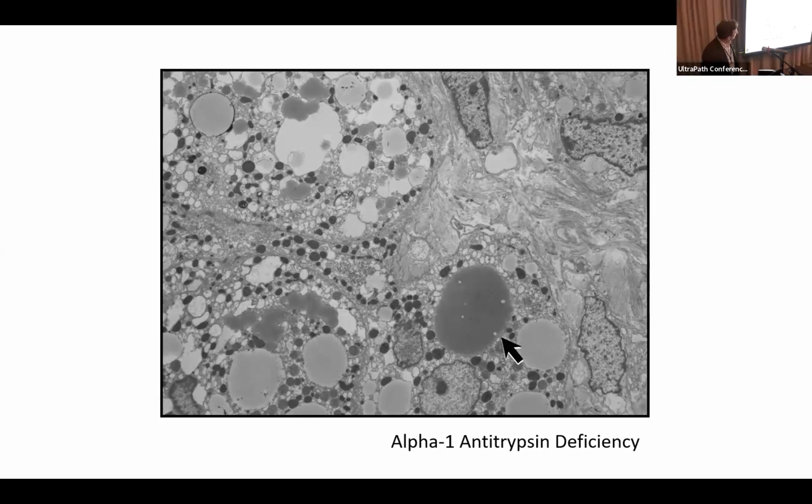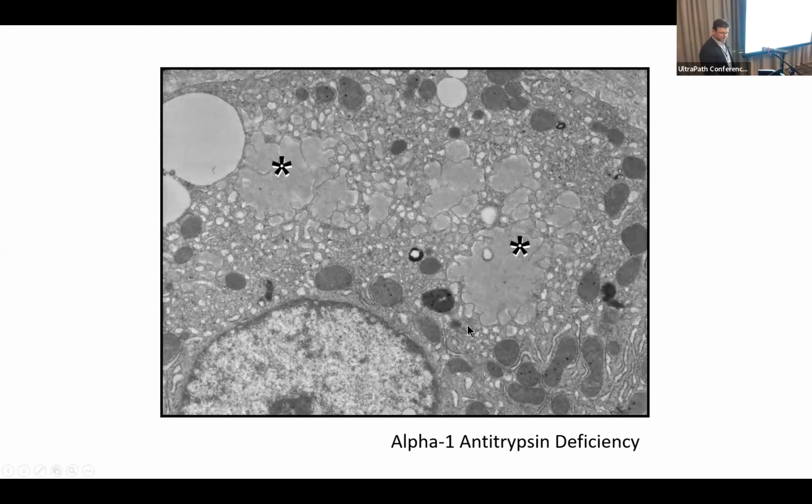These globules are PAS positive, PASD resistant globules, and when they're this large, they're very easy to identify by light microscopy. The older children usually do not present with cholestasis, but infants, on the other hand, usually present with a cholestatic disease that mimics many other disorders.